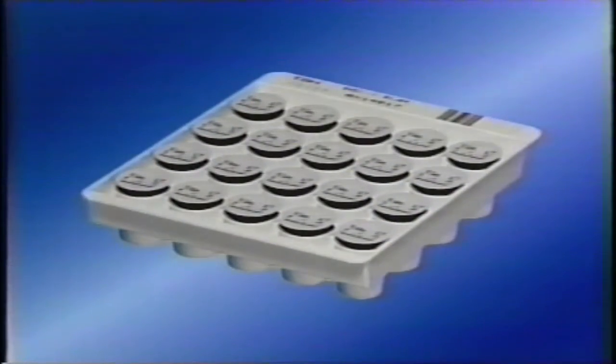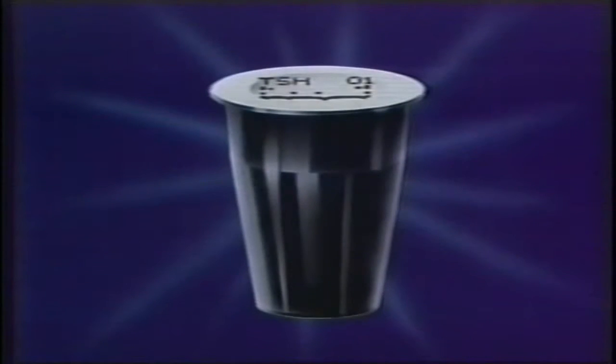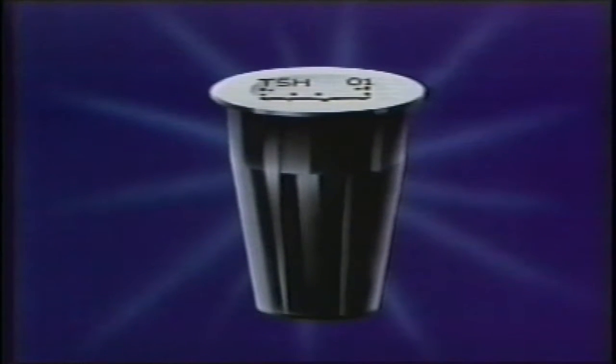The AIA-packed test cup contains two primary elements: magnetized microbeads coated with an antibody to the analyte being measured, and the enzyme alkaline phosphatase, conjugated either to a second antibody in sandwich assays or to an antigen in competitive binding procedures.